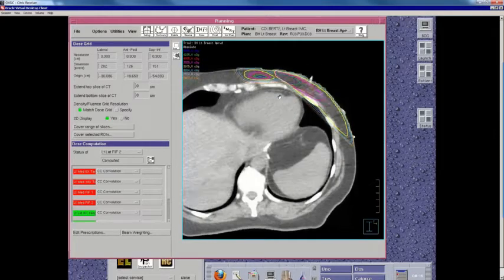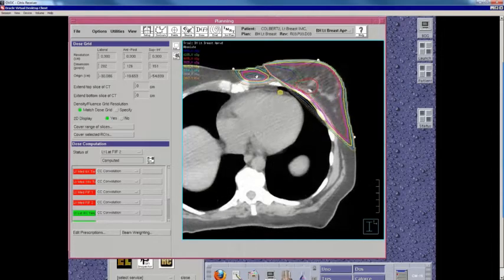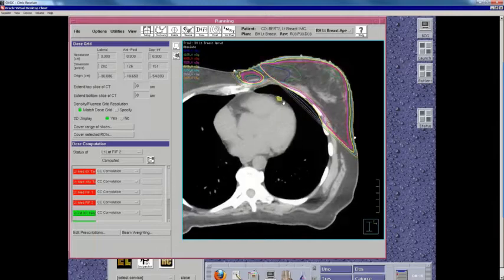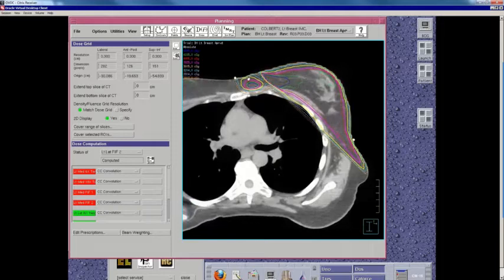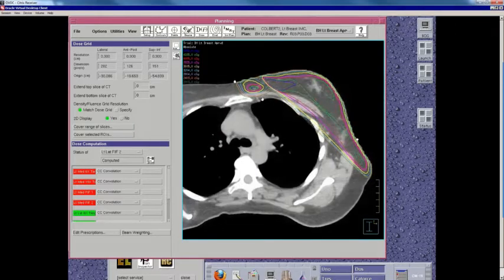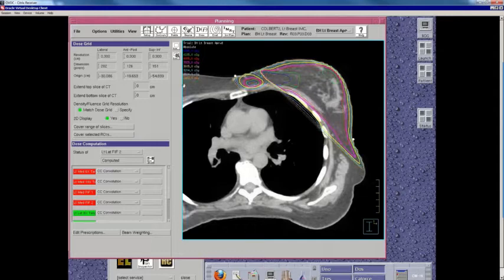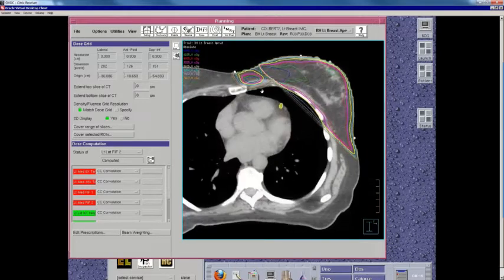And you can see that we have really nice dose coverage of all the breast tissue, and we have good medial breast coverage, and the LAD is basically in the shadow of the electron field and is getting very low dose. And as far as picking out the right electron energy for this field, my goal was to cover down to the ribs, or at least the middle of the pectoralis muscle, and try to get the 50% isodose line, here shown in green, to end within the chest wall and not extend into the lung. So this has turned out really nicely.